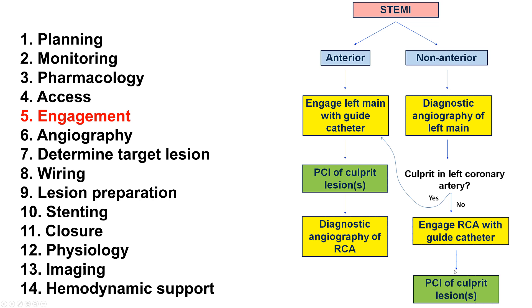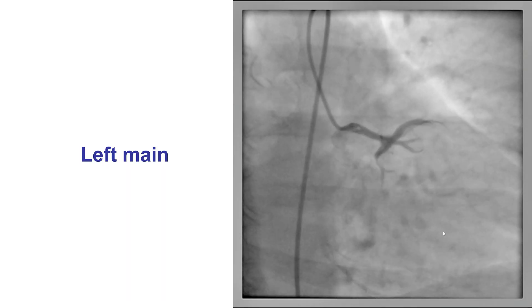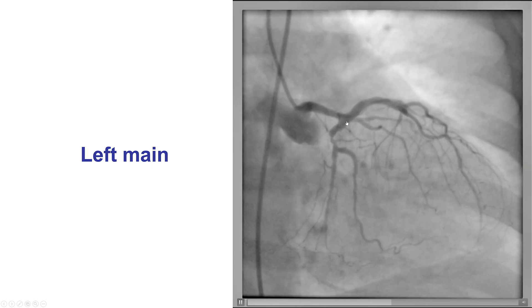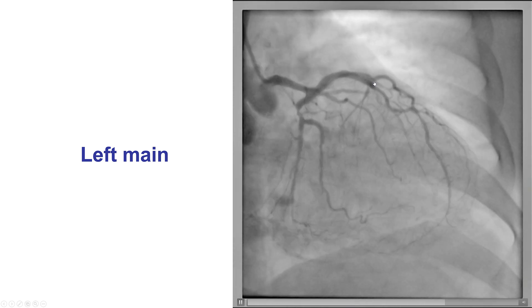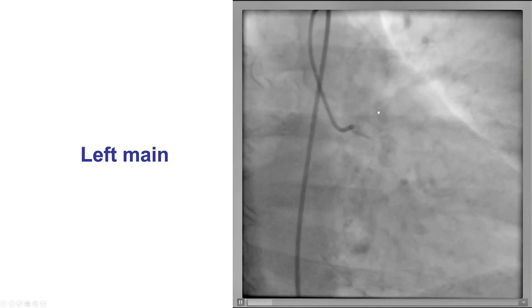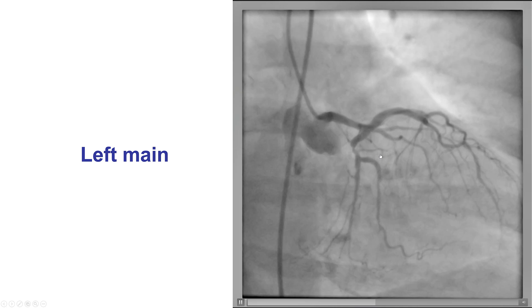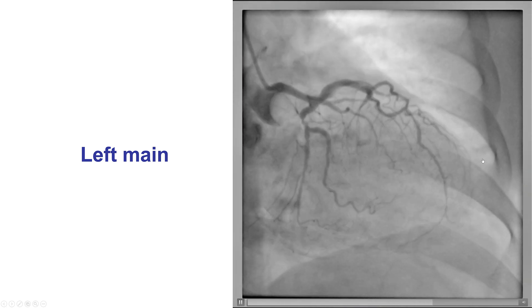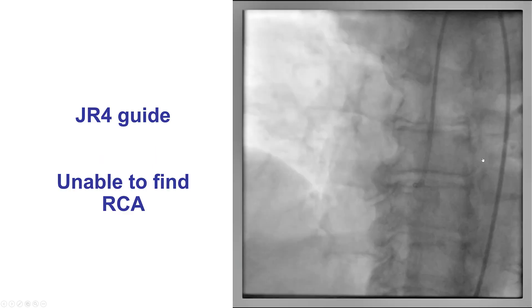For example, if it's an RCA with three-vessel disease and left main that will eventually require bypass, we might do balloon angioplasty only of the culprit lesion, and then the patient may subsequently go for coronary bypass graft surgery. So in this case, we first did the diagnostic angiogram of the left main. There are lesions in the circumflex and the LAD, but there's no culprit lesion here.